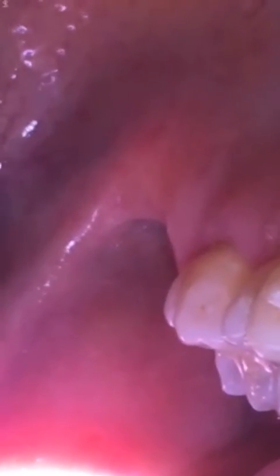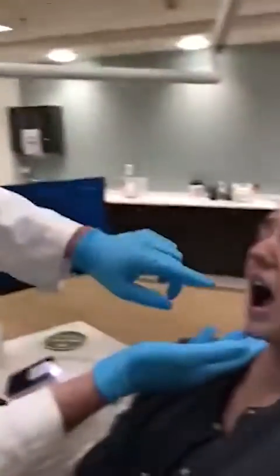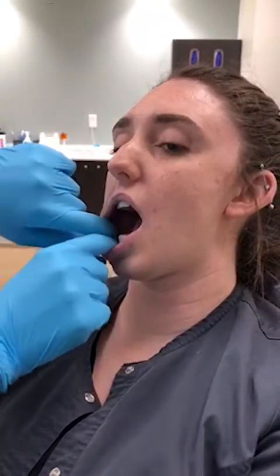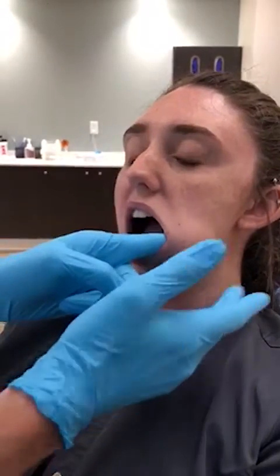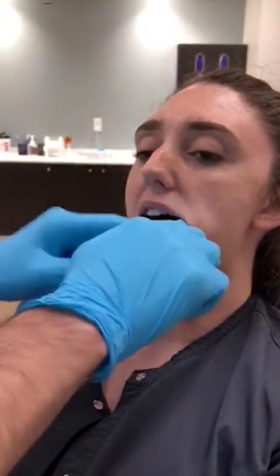I'd first like to show you how I do my oral examination. It can be done differently, but I do recommend a sequential approach. I start by having the patient open her mouth. We'll start in the right buccal mucosa and then move forward into the mandibular vestibule and the labial mucosa, and then I move to the contralateral side, again looking at the vestibule and buccal mucosa.